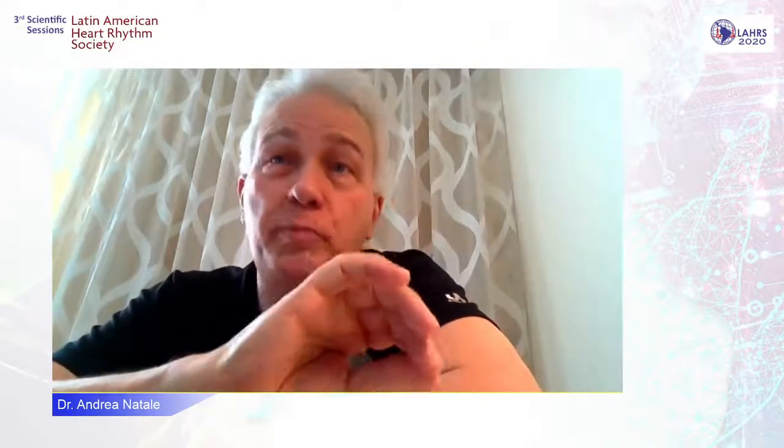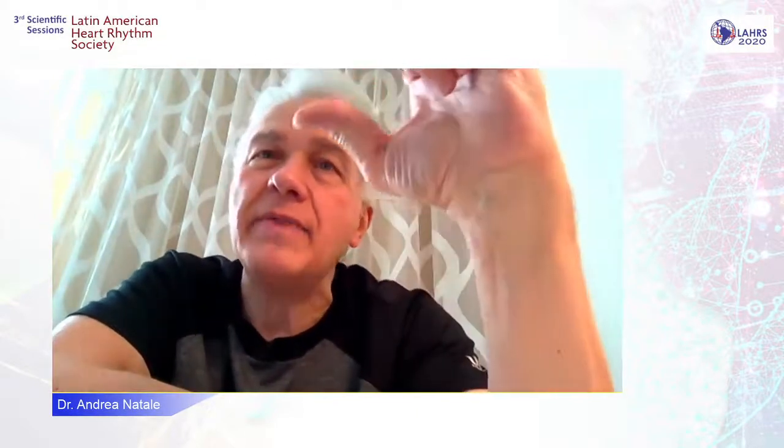One thing that I want to mention is that this is a common mistake. We're trying to publish that. I guess imaging people don't like electrophysiology telling them they're making a mistake in the way they read TEE. But we have very good academic places, with dedicated imaging people, that make a mistake in the way they assess the velocity in the appendage. Sometimes these patients have big diastolic waveforms, which are clearly passive. They are not after the P wave, they are in the middle of the diastole, and they are read as normal velocity. That's a mistake.